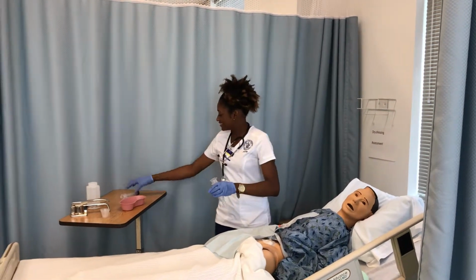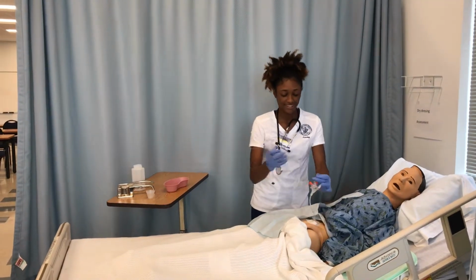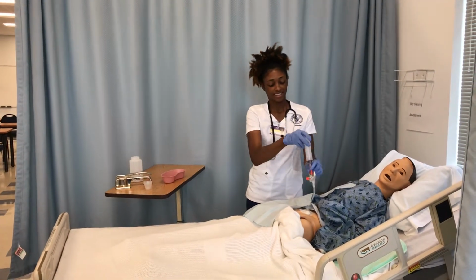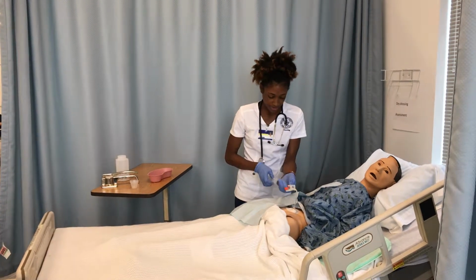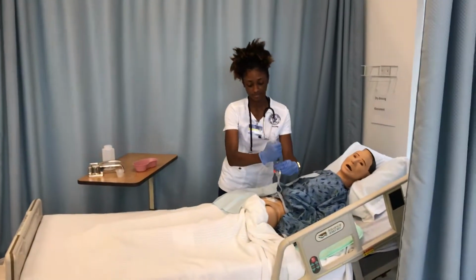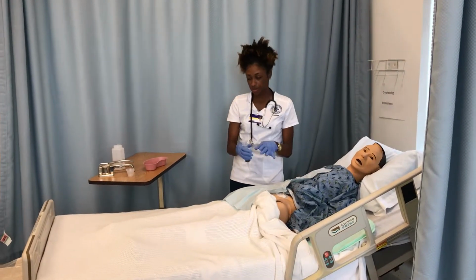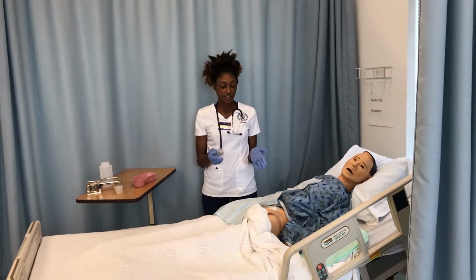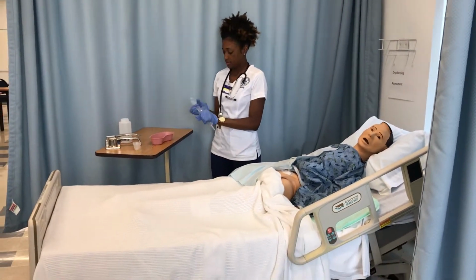Before I administer my nutrition, I'm going to check for residual. So I insert my syringe, open my valve, and draw back. Okay, Mr. Smith is only at 40 cc's, so I can go ahead and administer the nutrition. Close my valve again. If it's less than 100 cc's, we're good to continue. If it's more than 100, I come back in an hour, assess the residual again, and then call the provider if it's more than 100 when I come back. Okay. Let's go ahead and remove this.